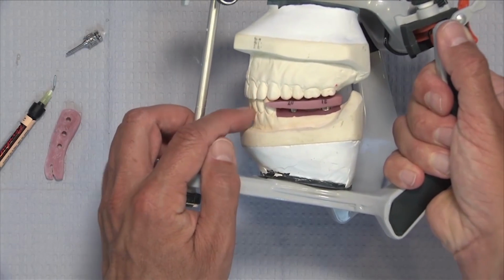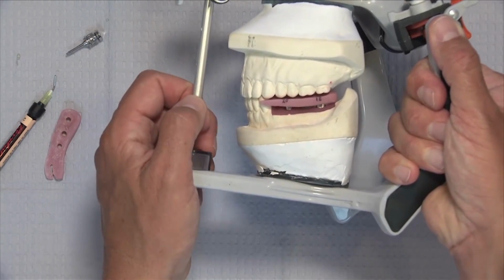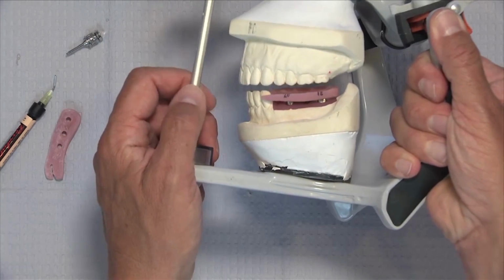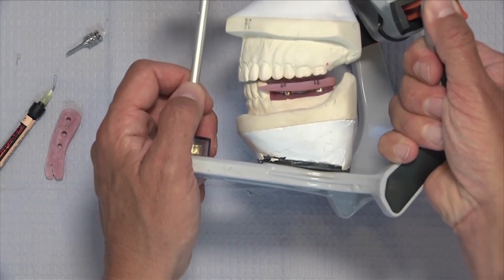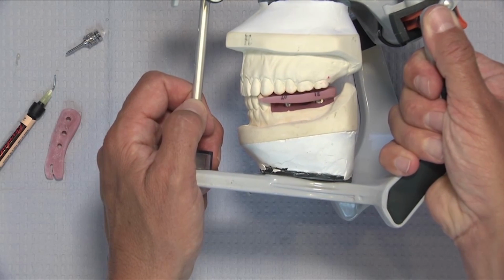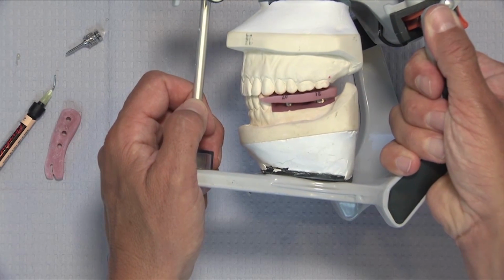In fact, we want to mark these anterior teeth with articulating paper ahead of time to see what maximum intercuspation looks like, and then we want to make sure and verify that that is still happening now when the patient bites together. I'm going to go ahead and repeat those same steps for the other side now.